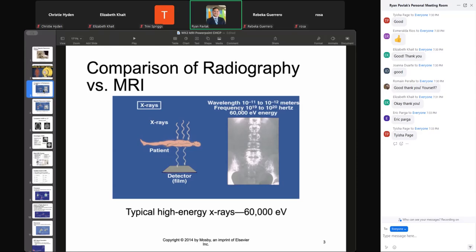An object that is more dense in terms of thickness, hardness, we're able to image with X-ray, right? So the X-ray beam goes in, the more dense objects absorb and stop more of the radiation. Whatever radiation makes it through to the imaging plate, that's the X-ray image that we get. With MRI, we're looking at the density of hydrogen in the different body parts.